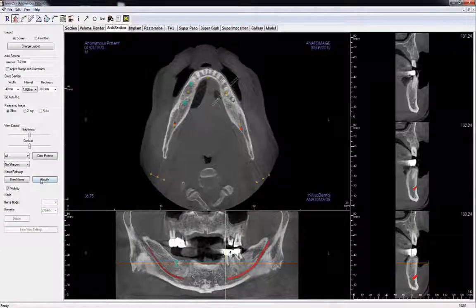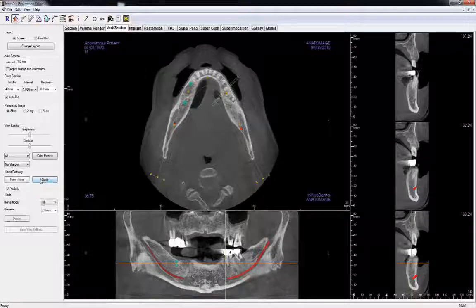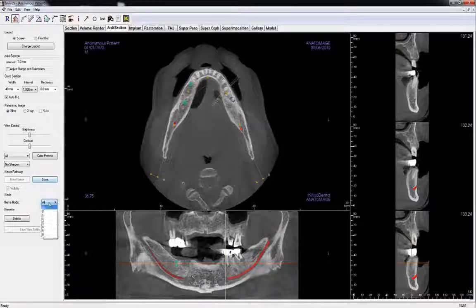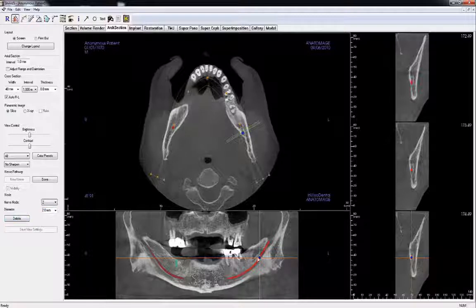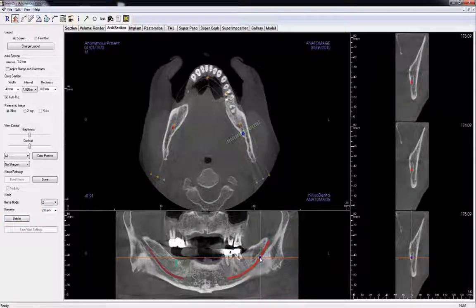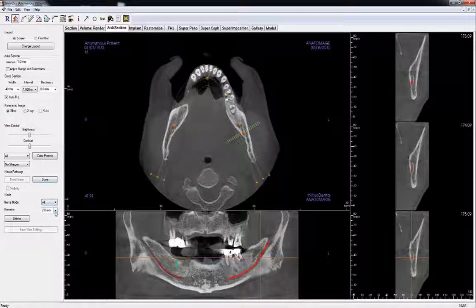With the nerve already selected, you can modify the nerve by clicking Modify. You can select a particular node to change its diameter, delete, or adjust its position. Additionally, you can set the diameter for the entire nerve.